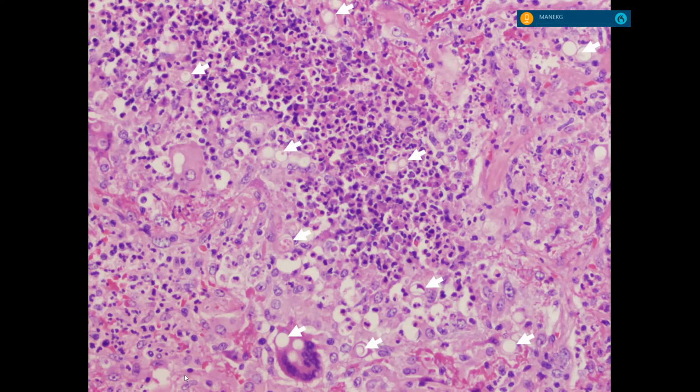One of them is in the giant cell actually. This guy. It's tough because you're not sure if it's just a vacuole. It's not the classic thing with a wall. Hopefully they'll give you a more classic one, one organism, easier to see.